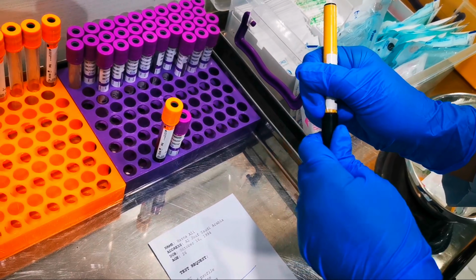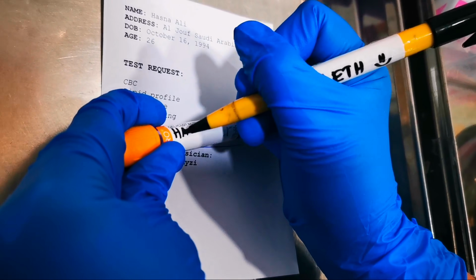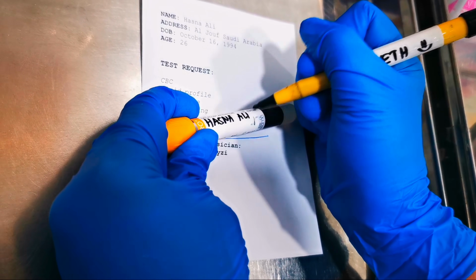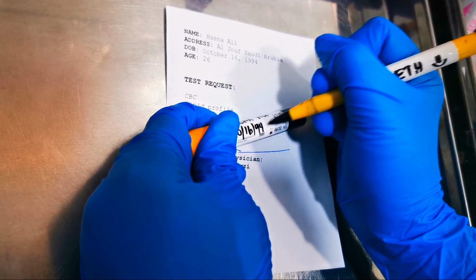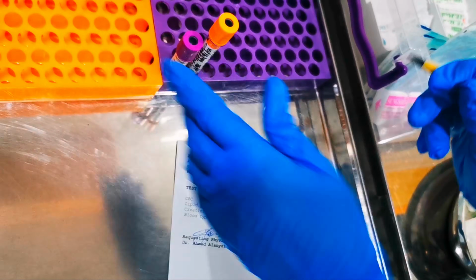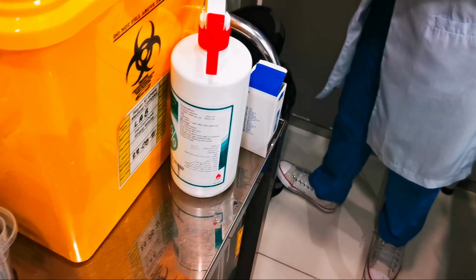Then it is the time to put the name now. So sa name, put the name first, and then the date of birth, the age, and then the time of collection. Date and time of collection. Last is tingnan mo ulit yung request and then the label, check it if it's correct.